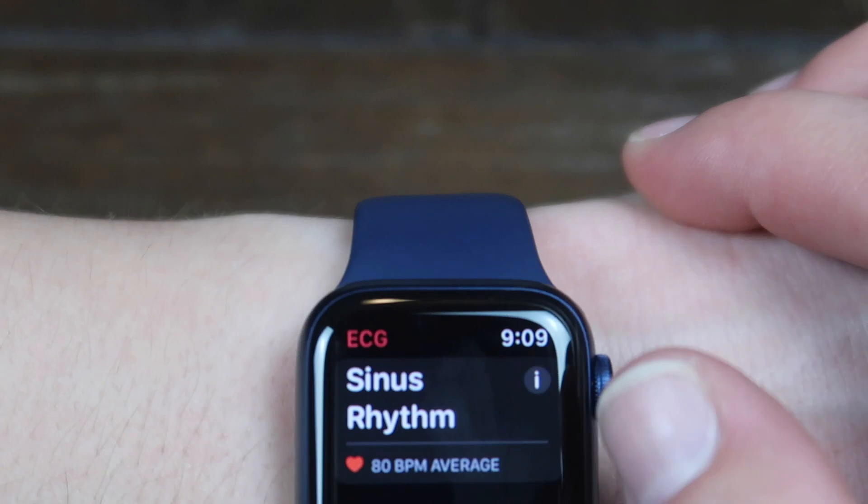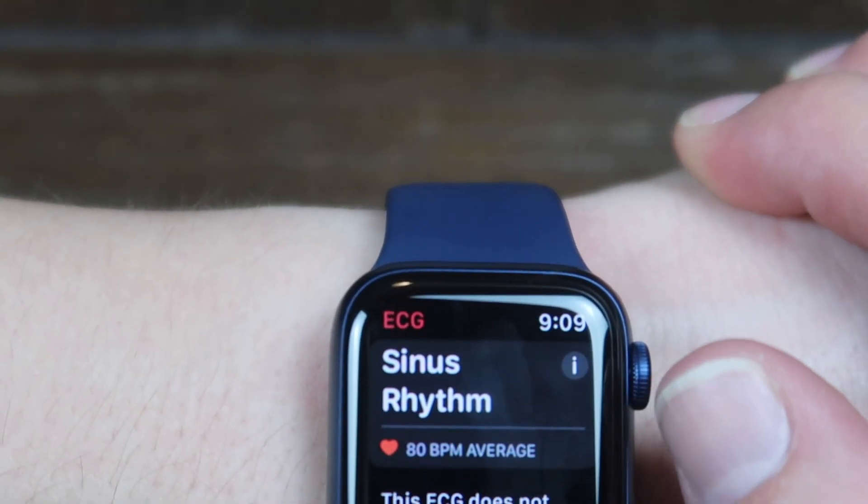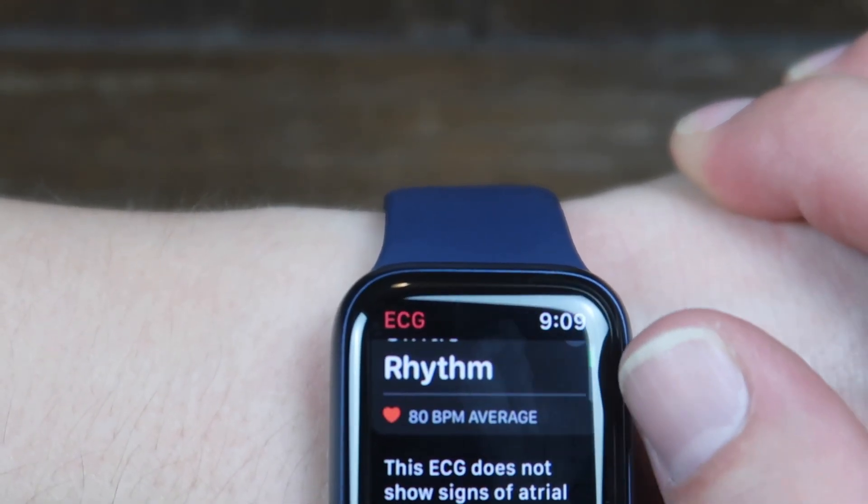And then it will give you the results. For me, it says sinus rhythm, which shows no signs of atrial fibrillation, which is good. I don't have to go to the hospital.